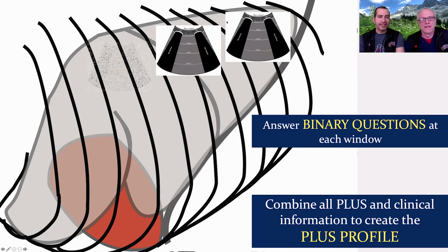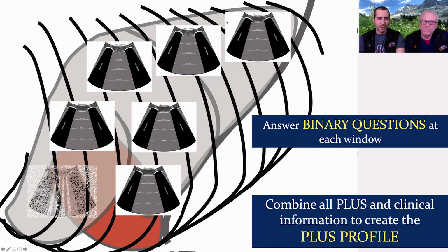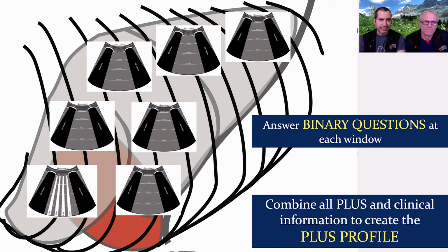So, Dr. Boysen, let's say I got a dog that comes in vomiting, then it's dyspneic and tachypneic, and I'm doing point of care ultrasound, dry. Whoa, one spot where I see 4 B lines. What is that? Yeah, a lot of people might think, well, it's only one spot. It's not a big deal, but it meets the criteria of more than 3 at that single site. That means this side of the chest has pathology in it.